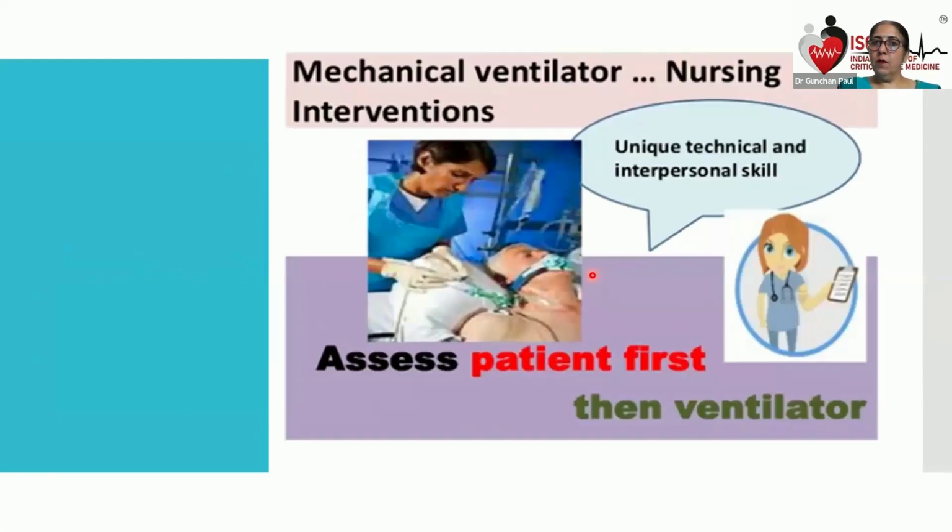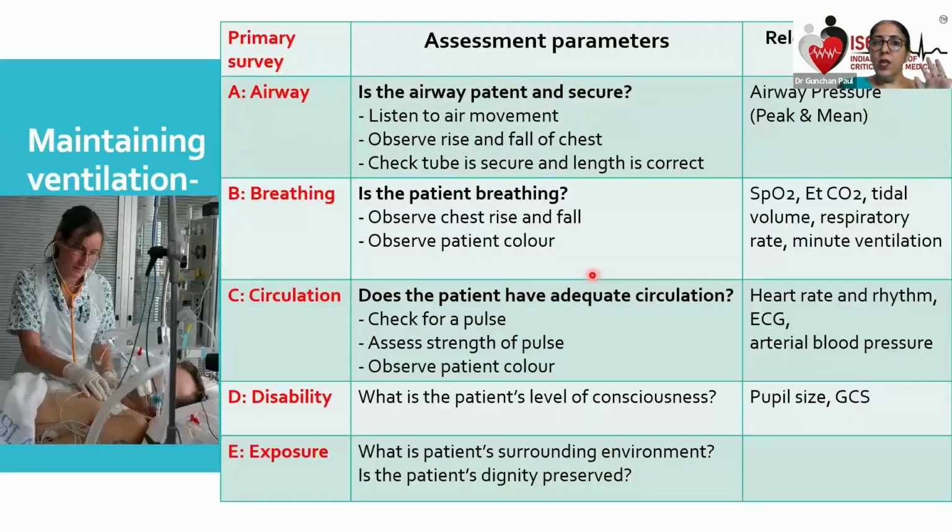When the nurses are the ones at the bedside, and if there is any problem, they are the first ones to respond. So your intention should be to assess the patient whenever there is a problem with the ventilator and then look at the ventilator. If there is an alarm on the ventilator, assess the airway.